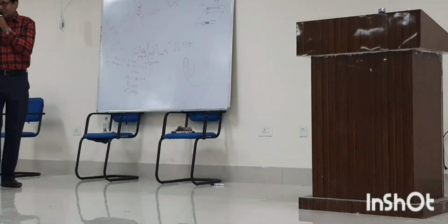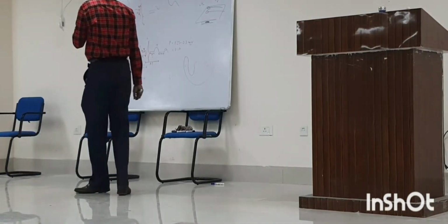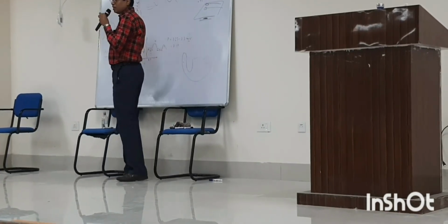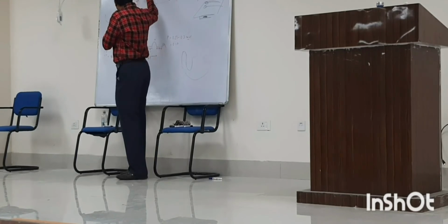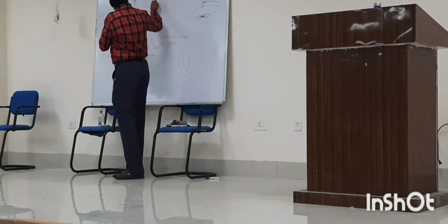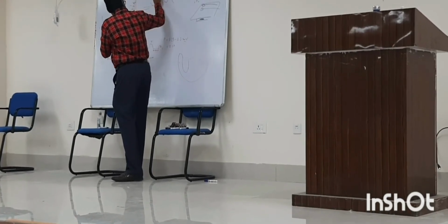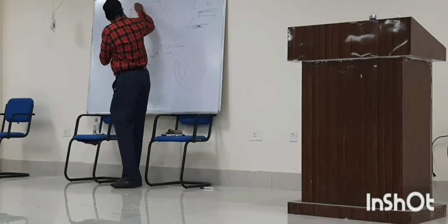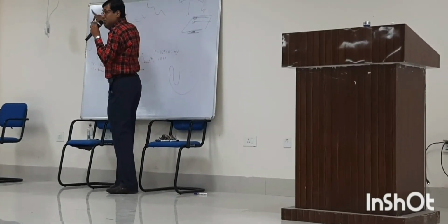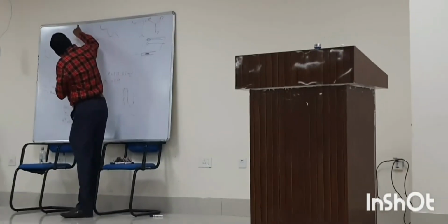And this is the mechanism of ST elevation. Phase 4 is directed away from the electrode. The baseline is shifted downward. It started from below. Normal Q wave, R wave, those are small, but it doesn't reach the baseline because it is already depolarized and direction is towards the electrode.